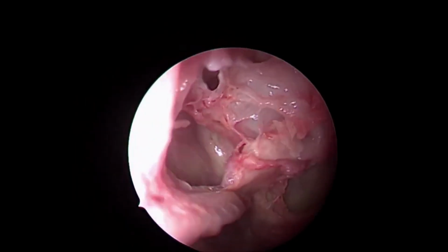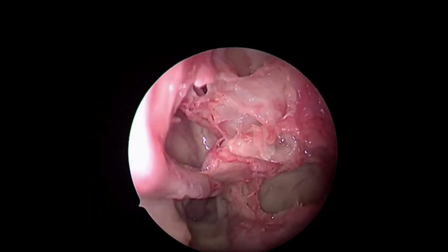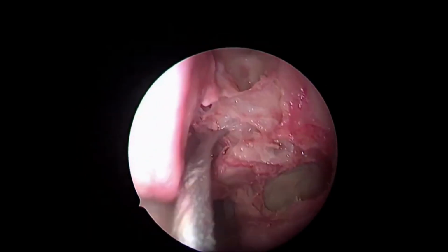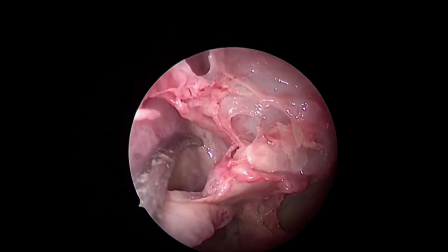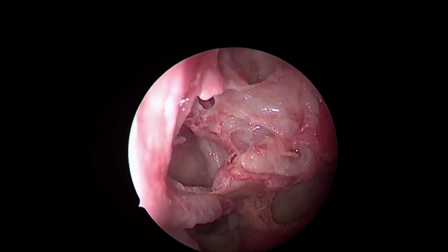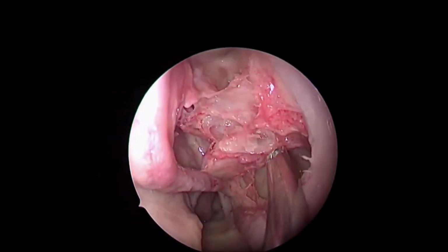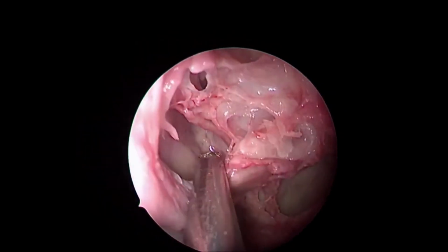In any given situation of an anomalous carotid artery or optic nerve or whatsoever in the sphenoid sinus, they would never come anterior to the sphenoid ostium. So, as long as you stay anterior to the sphenoid ostium, you never damage anything.